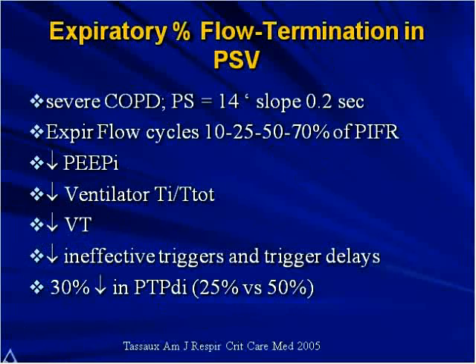Now, I think, again, like the pressure rise time, you can get a little bit too carried away with this. But I think with patients with COPD, going to like a 40 or 50% expiratory flow termination criteria may help. Remember, high levels of pressure support in patients with COPD doesn't help them that much. It can actually make their work of breathing much worse.